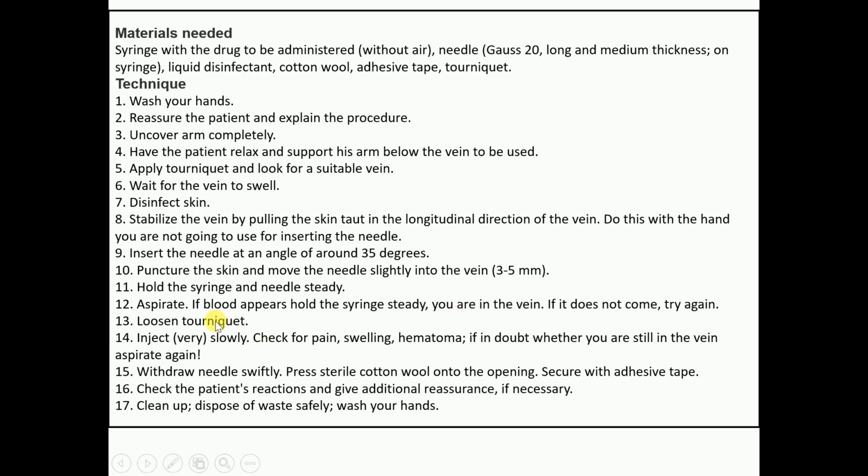Then loosen the tourniquet. Then slowly inject the medication. Then check for any pain, swelling or any hematoma. If in doubt whether you are still in the vein, aspirate again. Then withdraw the needle swiftly.